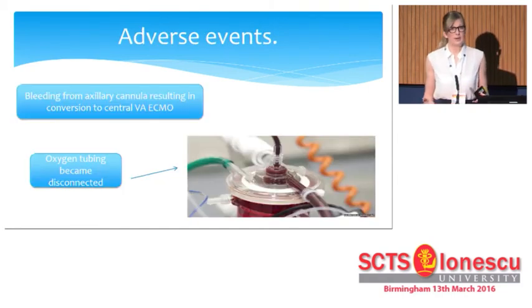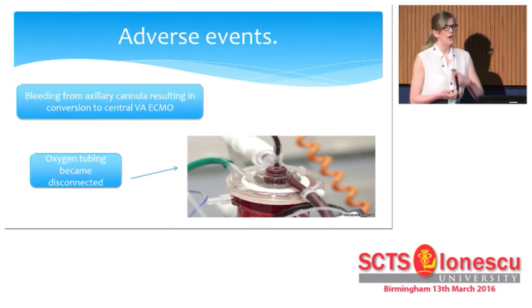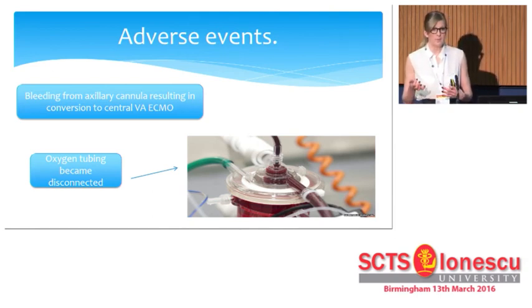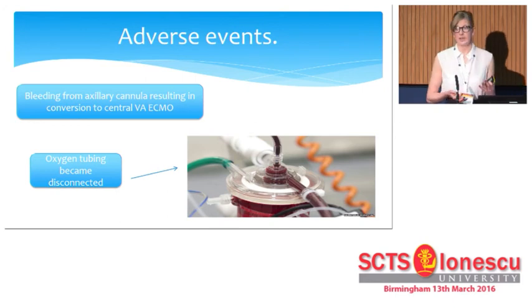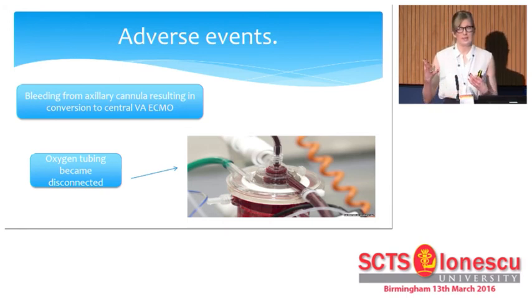So although I've spoken about how exciting and beneficial this was, unfortunately we did encounter 2 adverse events. The first was disconnection of the oxygen tubing to the oxygenator after we'd mobilised and the patient was settled in the chair. The patient became dyspneic, centrally cyanosed and desaturated. So we started bagging the patient, and the crash team came. Luckily, someone noticed the tubing had disconnected and reconnected it, and within a minute or so, the patient's values normalised. Apart from being a bit shell-shocked, he was fine, and there were no sustained issues from that.